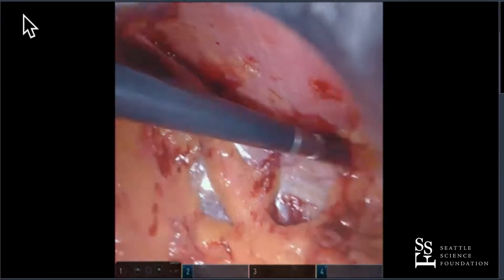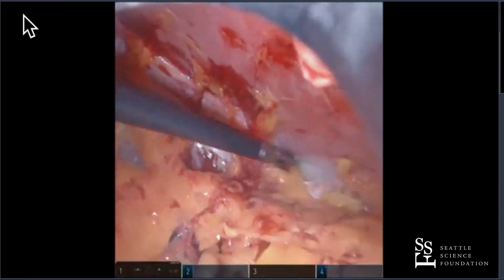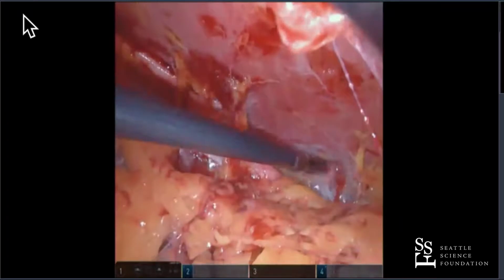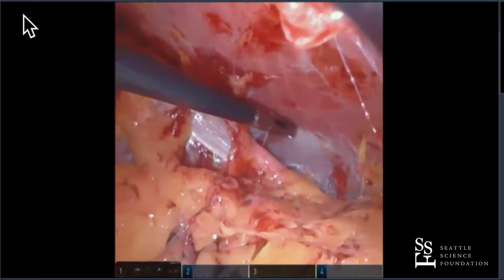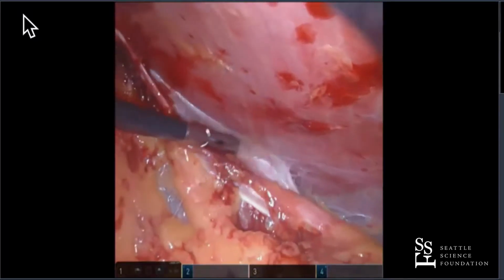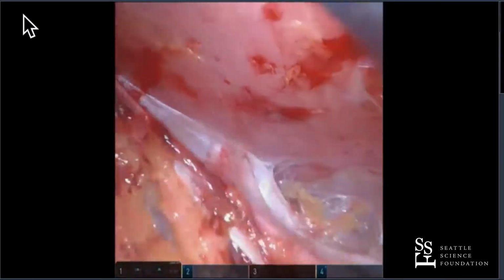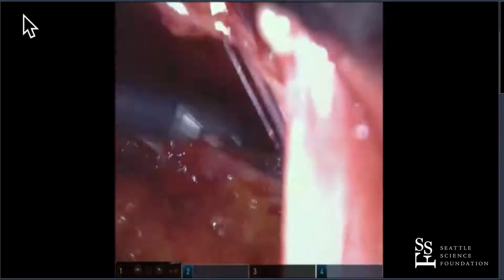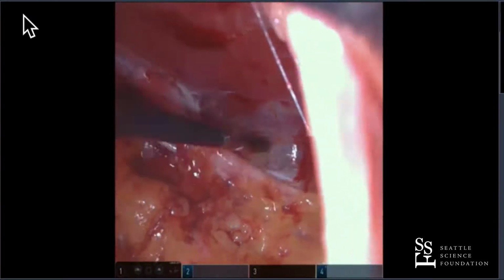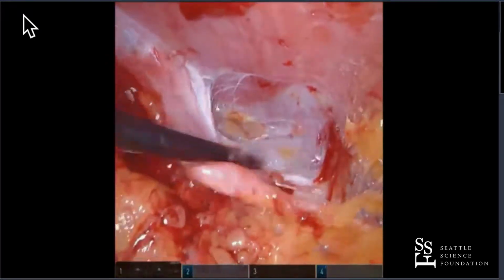All right, Terry, let's go back here now. It has a little cotton at the tip, so you can kind of twist it a little bit and pull the tissue off. What I'm doing now, I'm down in the lower retroperitoneum, and I'm just making space for my assistant. You can see, you can get a lot of distance here if you need it. That's it, Terry. That's nice. Back, come in a little bit, Terry. There you go. Perfect.